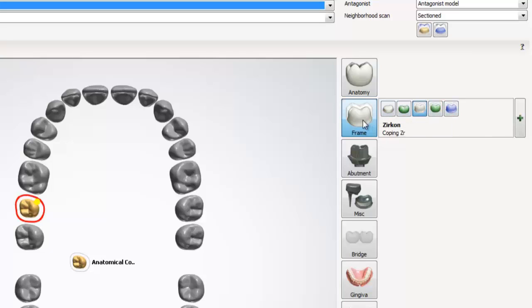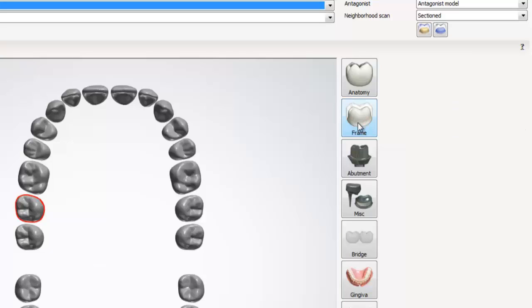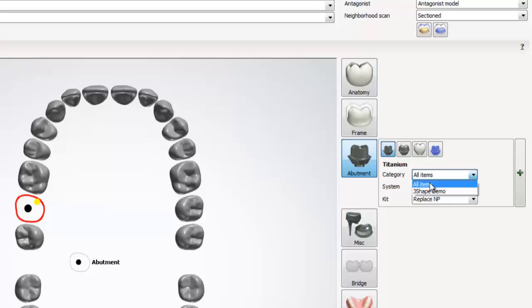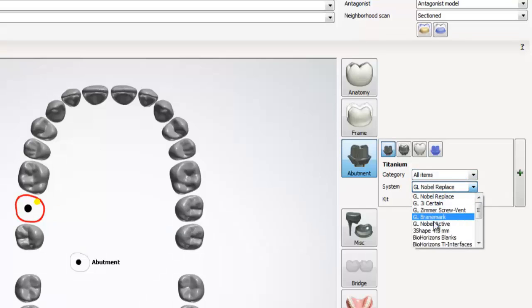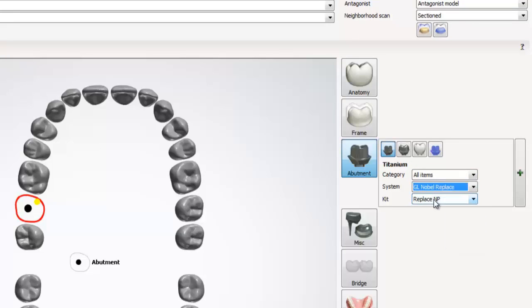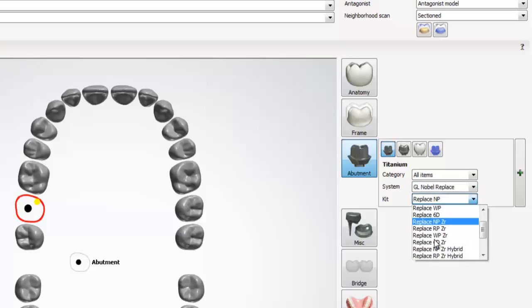The menu after frame is called abutment. Within abutment, we can select from a submenu of options. The first option is titanium, and is the default option. Within titanium, we can specify what system and kit we are using in the drop down boxes provided. The rest of the options within abutment work practically the same way. So I'm not going to cover them today.